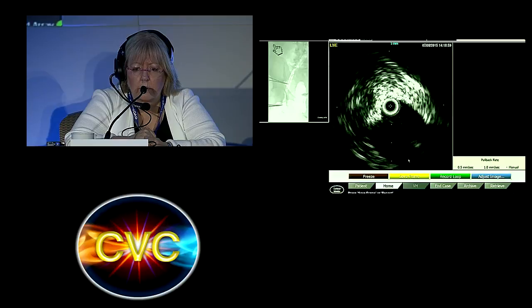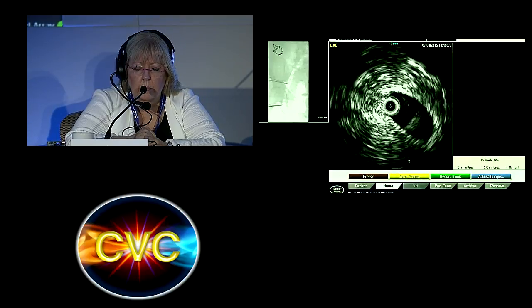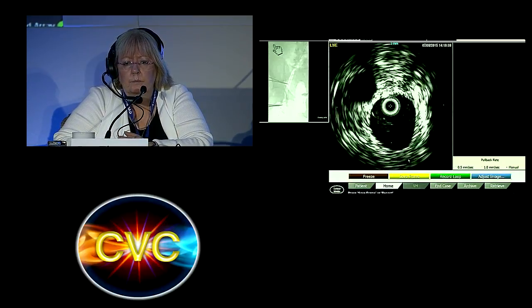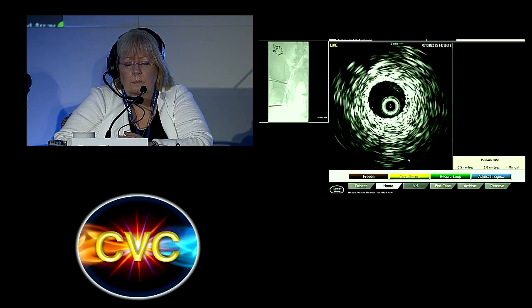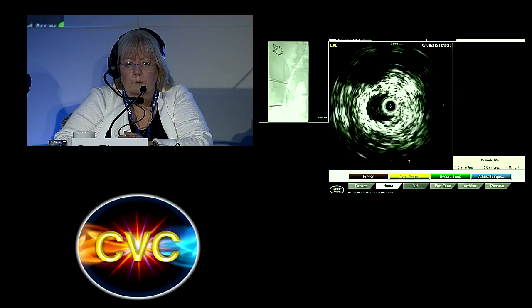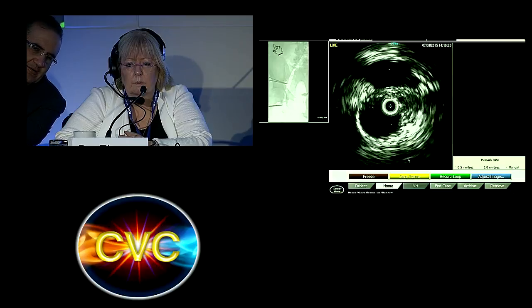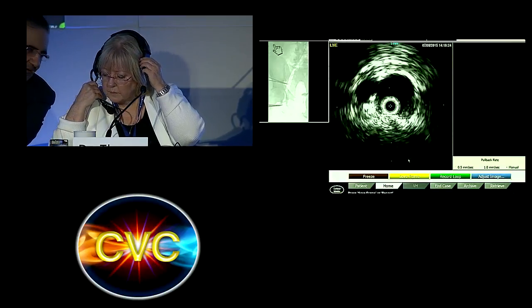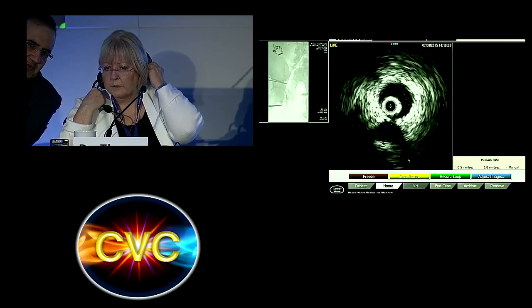Yeah, the vein looks pretty clean to me. We're already in the vena cava right there. Coming back again, down to the area of stenosis, and then to the end of the stent. All right, let's do another angio. If you can let it run, Van, you can show us a little more higher as well.